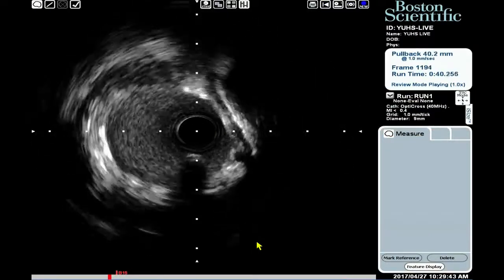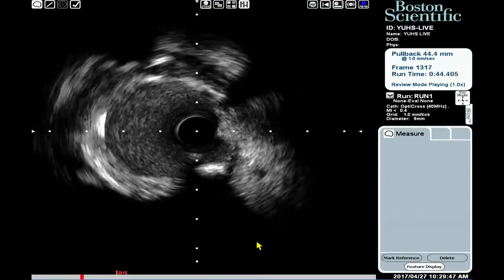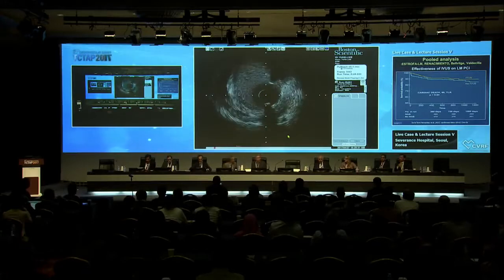Do you really think that you need one more stent? Well, I'd like to ask about it. Both. It's okay. Both for sure.